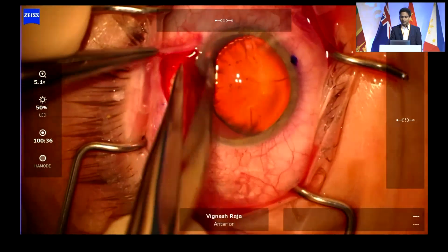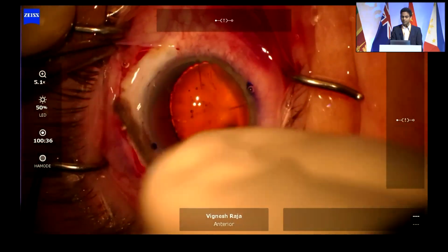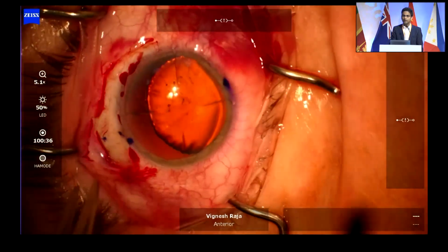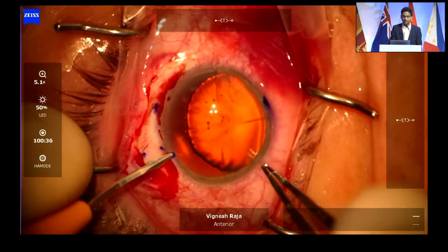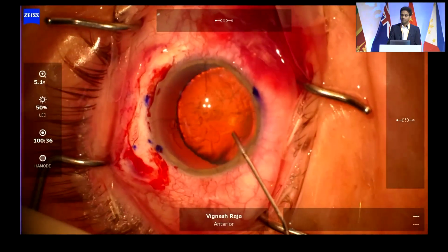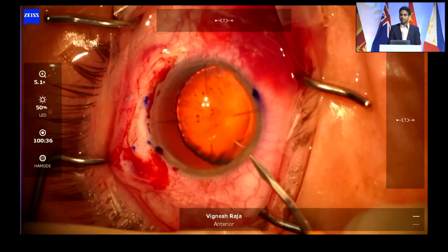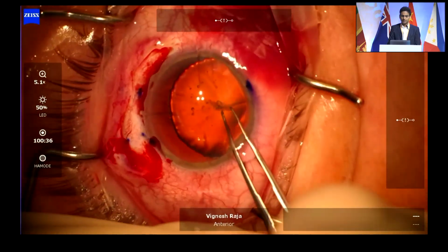So because of that, I'm preparing a conjunctival peritomy here. You need good diathermy, because when you make your sclerotomies, you don't want hemorrhage seeping into the vitreous cavity. Then you make your paracentesis as peripheral as possible. And when you make the incision, avoid the radial keratotomy incisions, otherwise they'll become full thickness corneal gapes, and then it's almost like treating a corneal laceration.